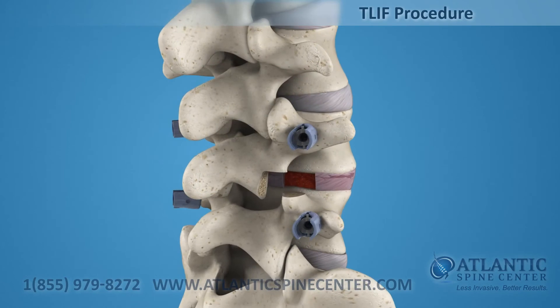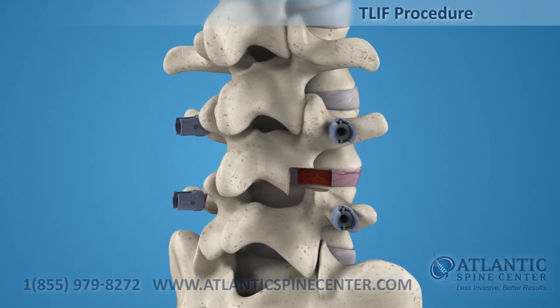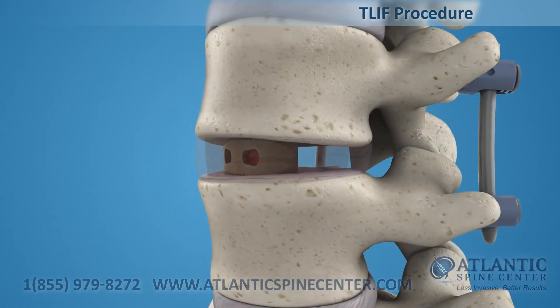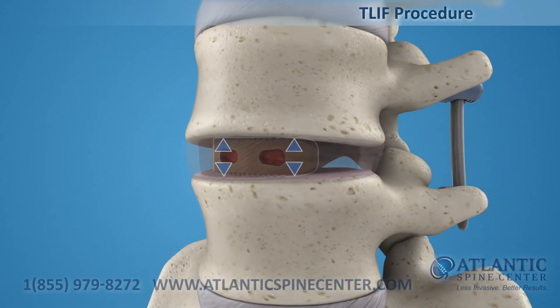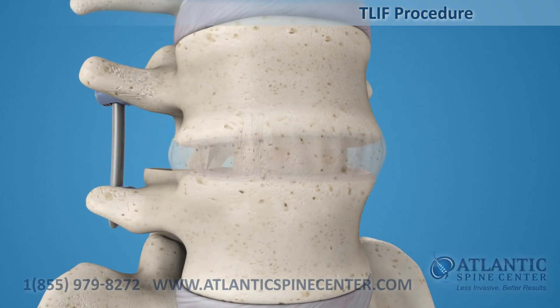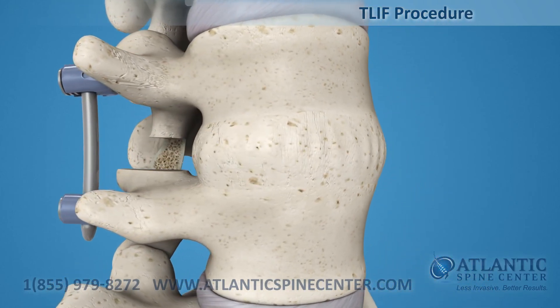This procedure is normally accompanied by a posterior fixation with pedicle screws or facet screws. The implant maintains the spacing of the vertebrae while the fusion takes place. After the fusion is completed and a solid bone mass forms, the two vertebrae are joined together.